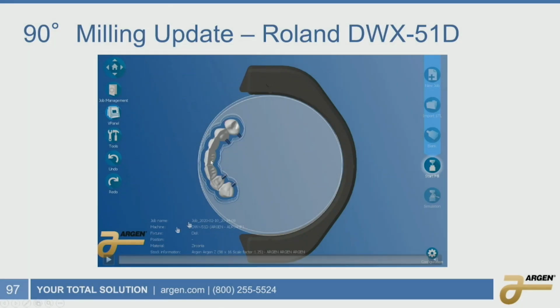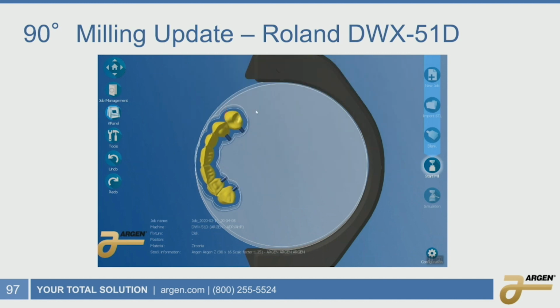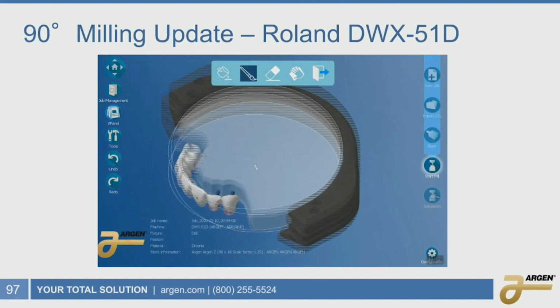So as we stand over here, we're going to move this out. So yeah, go ahead. Yep. So we're going to move the unit out until it goes yellow, which means it's cutting into this portion here. But again, there's no boundary from the C clamp. You're going to click that button, and it's going to open up the offset areas over here like this. And as soon as you click this, it's going to say, do you want to select the parts to be milled? And you're going to click yes, and it automatically opens up over here.